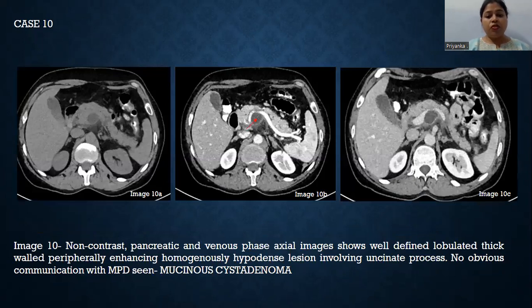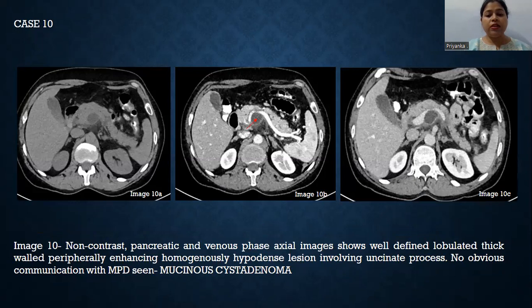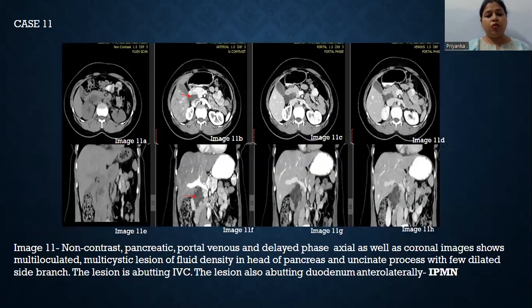This case demonstrates mucinous cyst adenoma. Non-contrast, pancreatic, and venous phase axial images show a well-defined, lobulated, thick-walled, peripherally enhancing, homogeneously hypodense lesion involving the uncinate process. There is no obvious communication with the MPD seen. These findings are in favor of mucinous cyst adenoma.